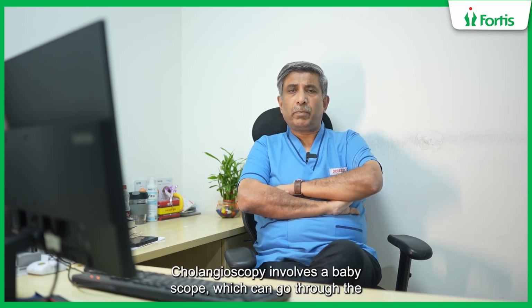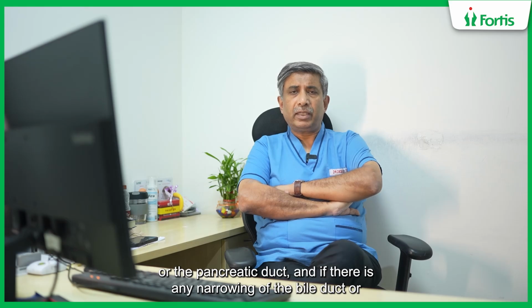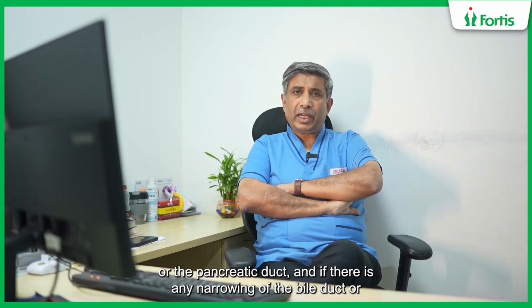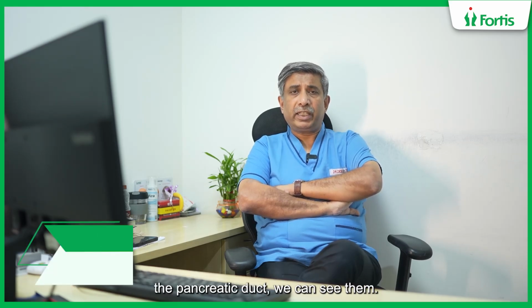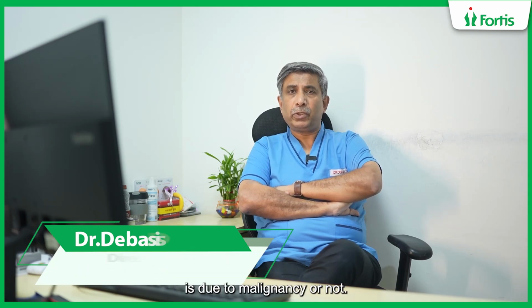Cholangioscopy involves a baby scope which can go through the ERCP scope inside the bile duct. So with the baby scope, we can actually visualize the inside of the bile duct or the pancreatic duct. And if there's any narrowing of the bile duct or the pancreatic duct, we can see it and take biopsies to make a diagnosis whether the narrowing is due to malignancy or not.